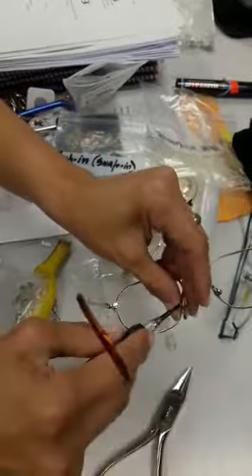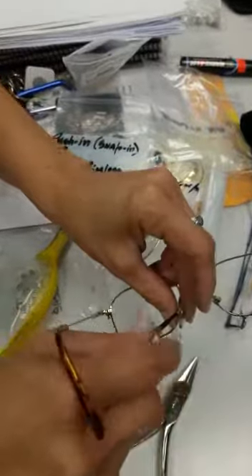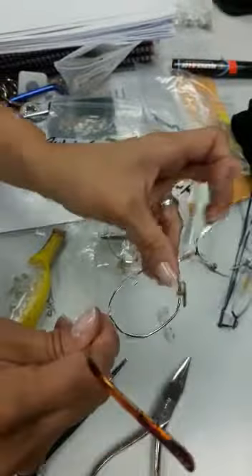Again, you put your finger there to support. Righty-tighty. And your nose pad is now wearing your face.